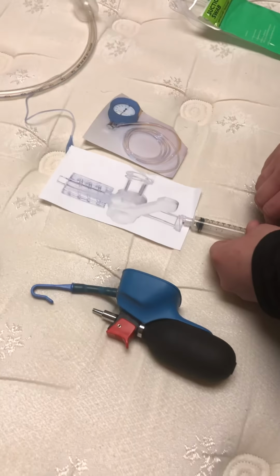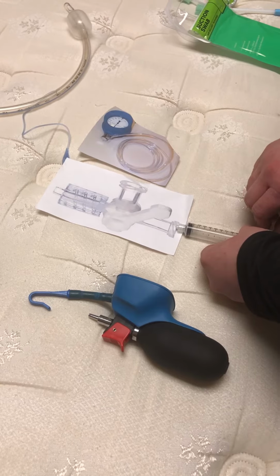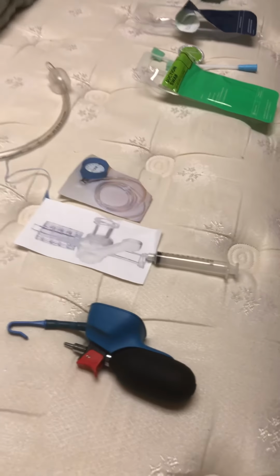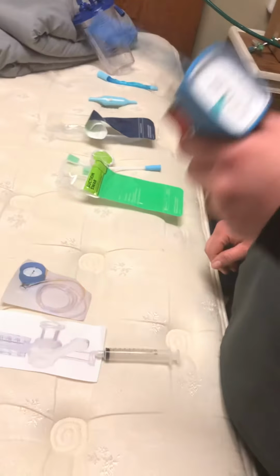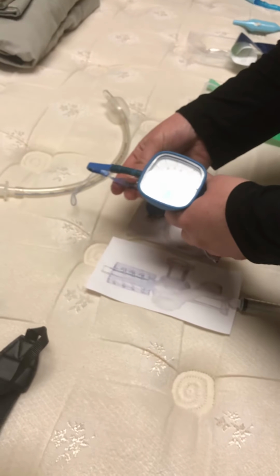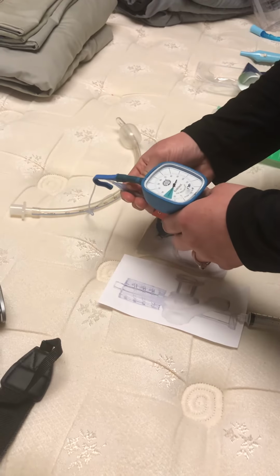And after you figure out and chart down what you heard, what you're going to do is listen, and you're going to slowly put the pressure back into the cuff, and you're going to listen for when that leaking stops, and take note of where it was at when you heard it stop. And so the next thing you're going to do is take your low pressure cuff, and you're going to apply it to the patient's cuff here, and you're going to take note, see where it's at.